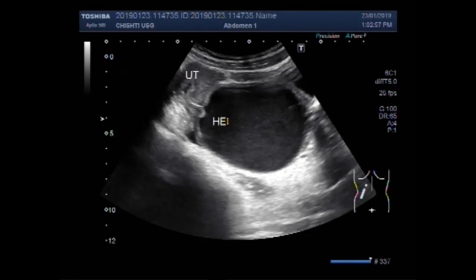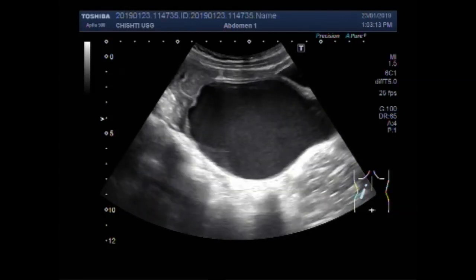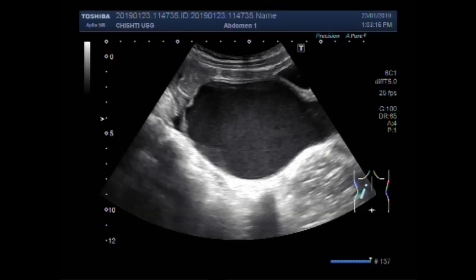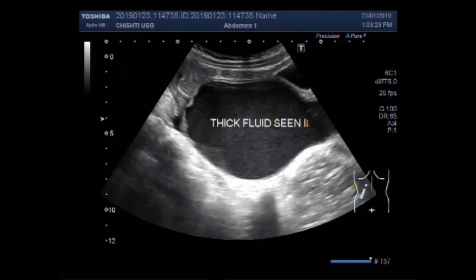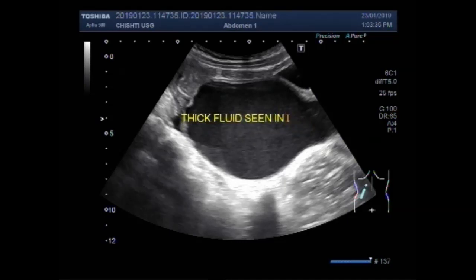The cervix is dilated along with the vagina due to the presence of thick fluid in its interior. Now you can see the cervix and uterus, the cervix and vagina. The vagina on the extreme right side of this picture is also dilated. This is thick fluid seen in the cervix and vagina.